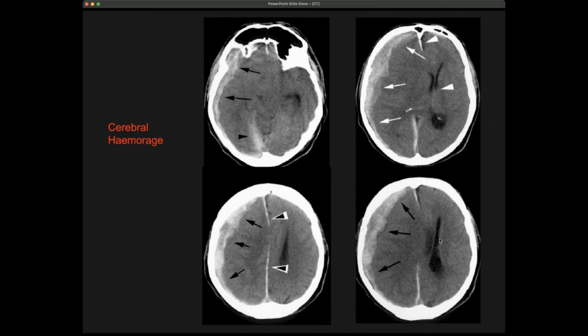If you look a little bit lower, you see these black areas in the brain. These are what are called the ventricles. You have a couple of hollow parts in the brain that are filled with fluid, cerebrospinal fluid. So fluid is dark. One of the things on CT is that you don't see the difference between white and gray matter in the brain. We will see in one of the next lectures that with magnetic resonance imaging you do see the difference, but on CT you can't.